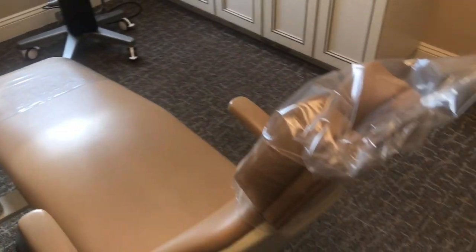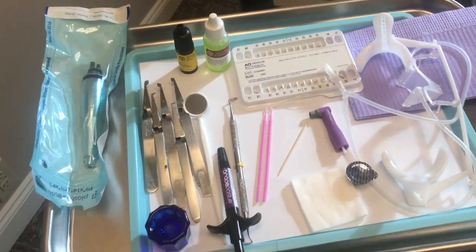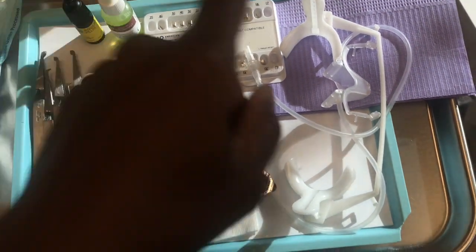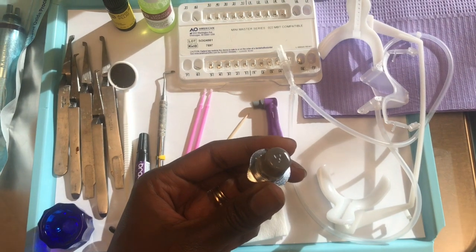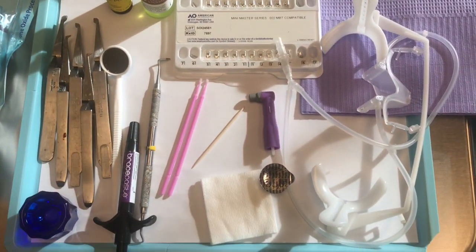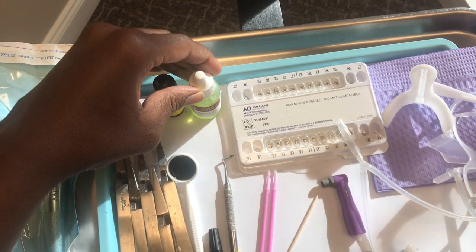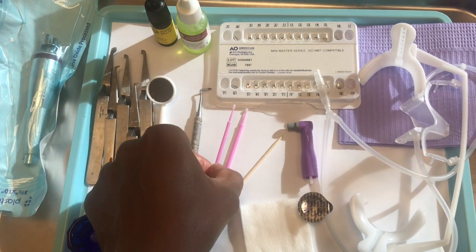Here is our setup — we have everything that we need to start putting braces on our patient. Back there is the iTero machine that we used first. We have a bib for the patient, and up here we have all of the braces. Here we have the cheek retractors along with the NOLA that keeps the patient dry. Here we have the prophy paste and the prophy head, which is used to clean the patient's teeth, along with the handpiece that attaches to it. Next we have Etch, also known as conditioner, and we'll use a small micro brush — this pink brush — to apply the conditioner on the patient's teeth after we clean them with the prophy paste.